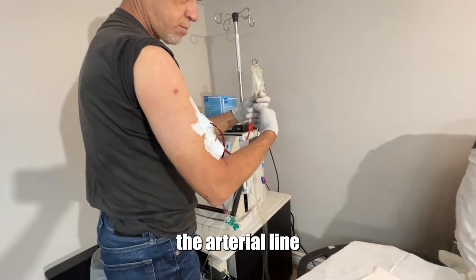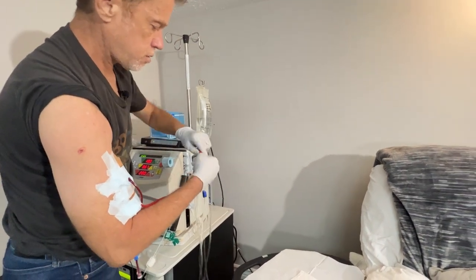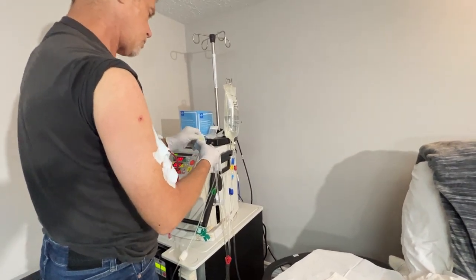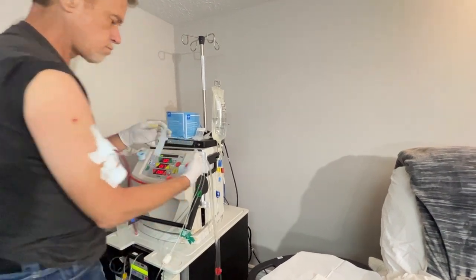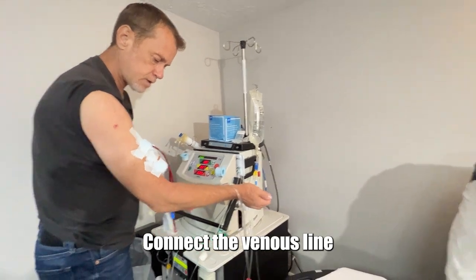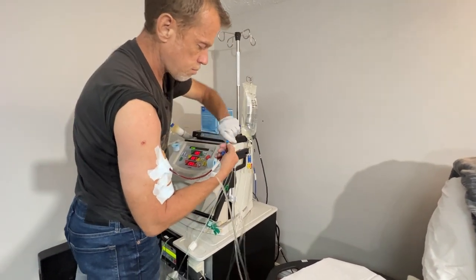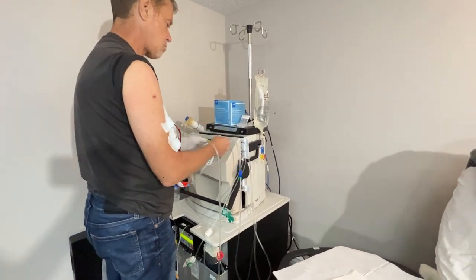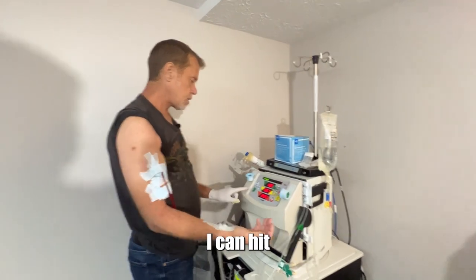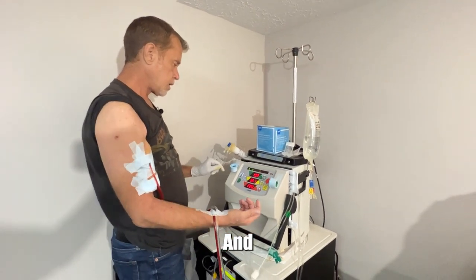Go back and make sure there's no air. Now I am ready to go ahead and connect myself to the machine and begin treatment. First, I connect the arterial line — always check your clamps. Next, connect the venous line — again, check your clamps. Now that I'm all taped up and my lines are connected, I can hit the green button to start treatment. Shaped like a kidney, of course. And here we go — the machine is firing up.